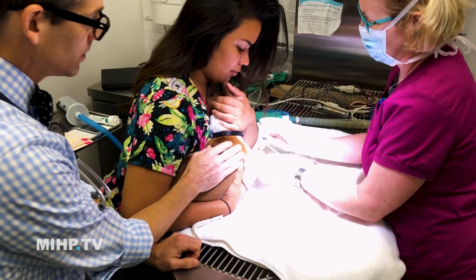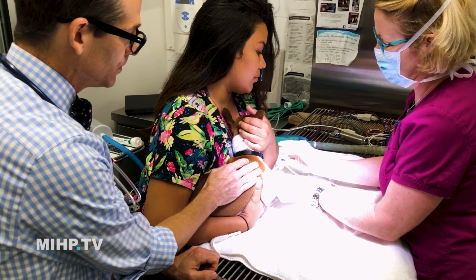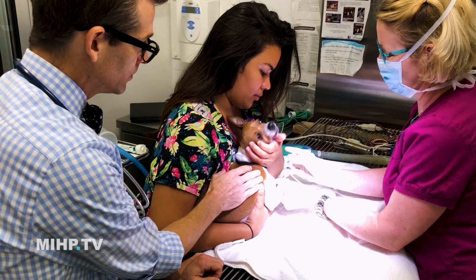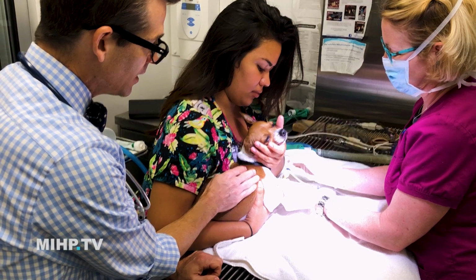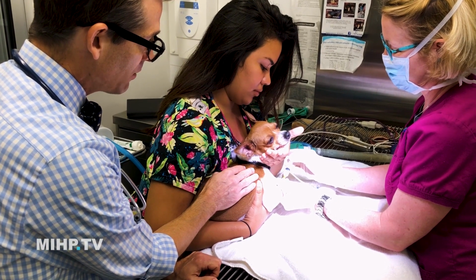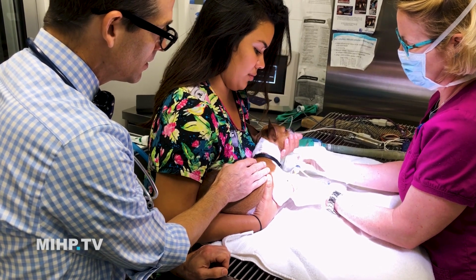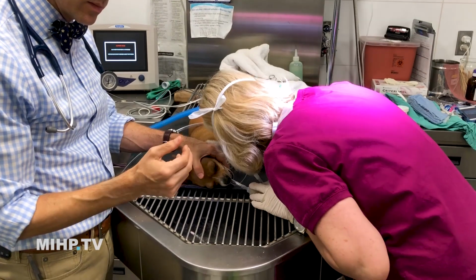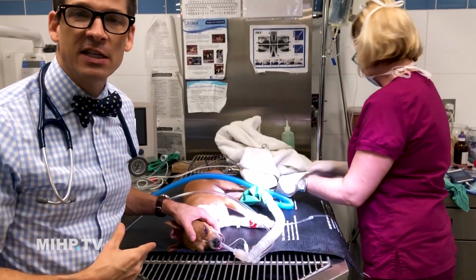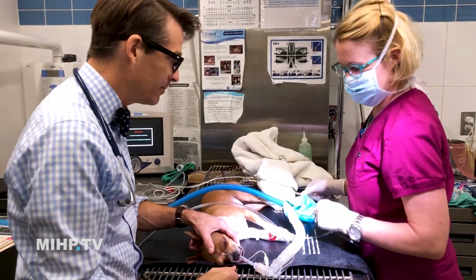We are giving propofol. This is what we're going to use to get her into a nice sleepy state so that I can intubate her. So completely knock her out. There we go. Count backwards from 10, 9, 10. She's going to check the seal. So she checks it to make sure there's not any gas escaping, so there's no fluid going down.